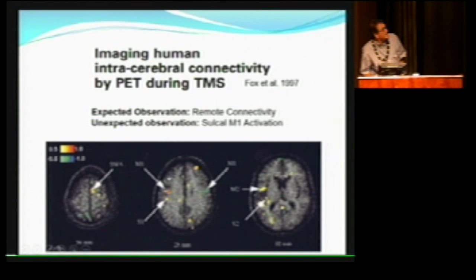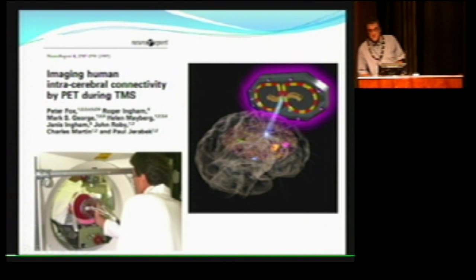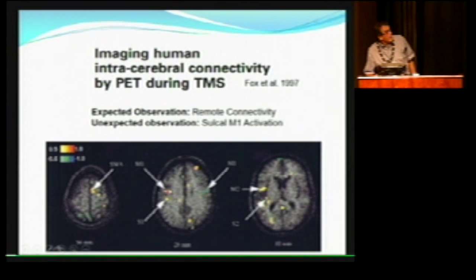The other thing that was quite clear is even though we'd been told to expect that this is going to be big, this isn't big, this is very, very focal, and it's not at the gyrus. It's deep. It's basically right at M1. When you're stimulating, we did record EMG, and although this was handheld at this time, we were monitoring EMG and making sure we were getting FDI contractions throughout for each subject, and we did. So we knew we were hitting M1, and we're getting deep responses and very appropriate network-based responses. We're getting contralateral inhibitory effects, which EMG absolutely confirms.